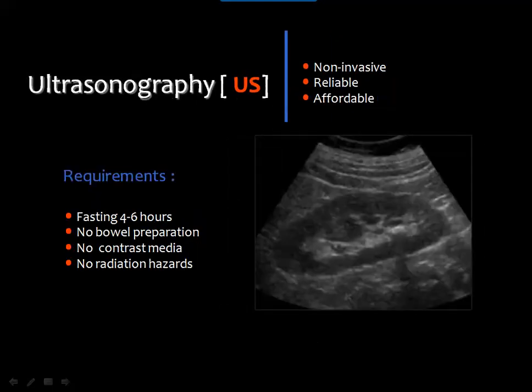Ultrasound is an old and recent imaging modality. It has a major role in evaluation of the urinary system over many years. Ultrasound is a non-invasive tool. It is reliable, relatively low cost, does not use ionizing radiation, and can go to the patient bed.